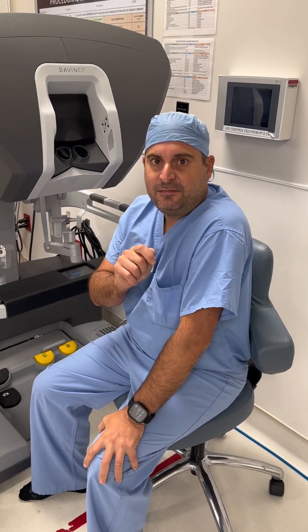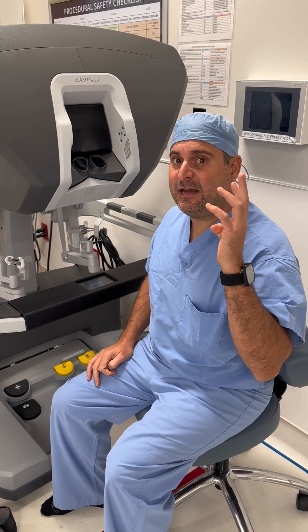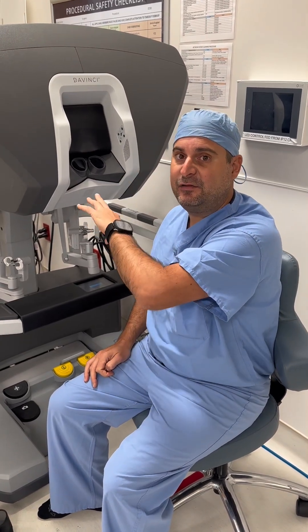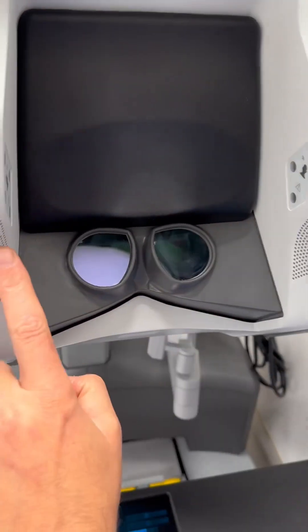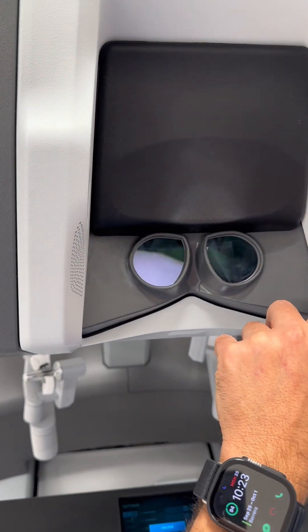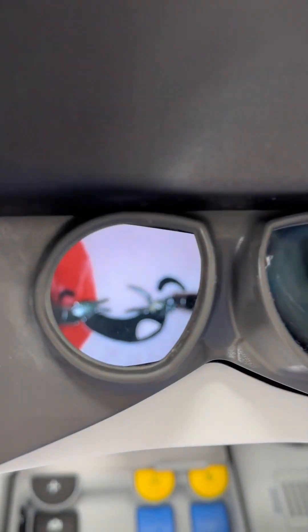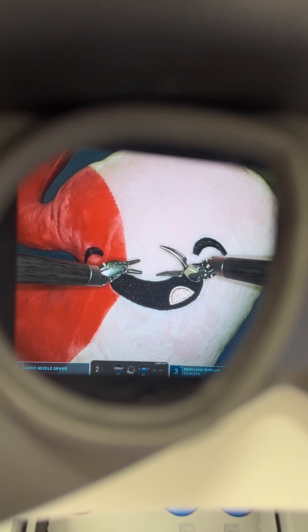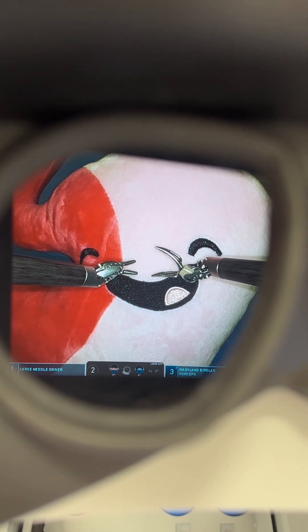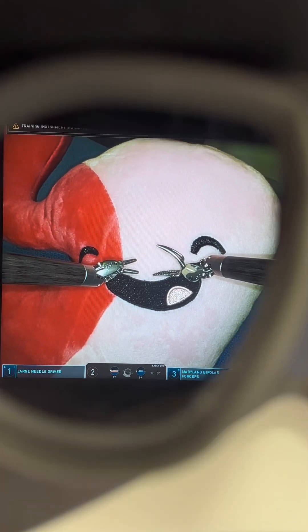The last thing I want to show you is the actual three-dimensional view that I have looking into this console. My head rests right here, there are speakers here, and there are sensors that know where my head is. But if you look inside here, I get this amazing three-dimensional view of what we're actually working with. That's what I get to see as a surgeon, and it allows me to see things I was never able to see before laparoscopically.